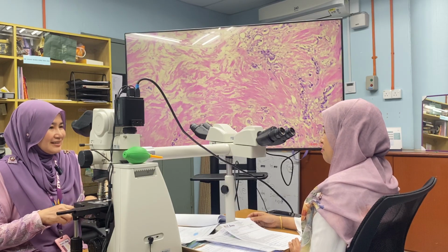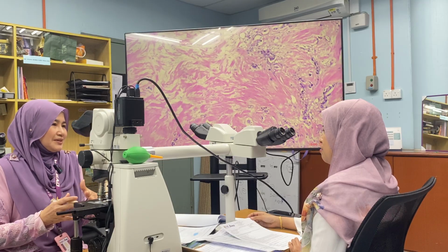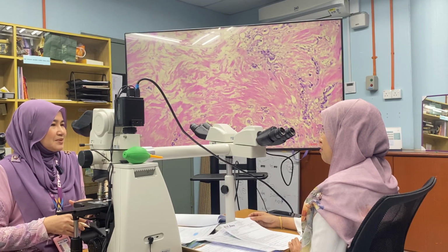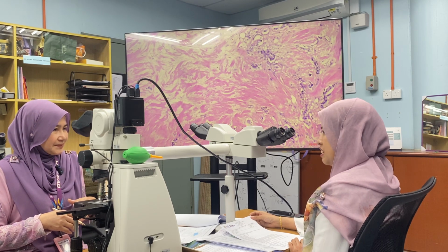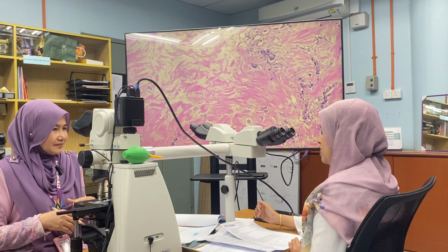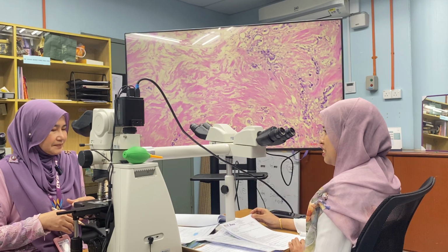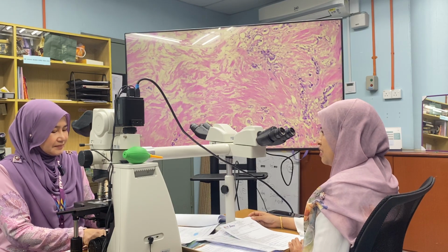Okay. What about the margins? How to report the margin? Is it similar for the mastectomy specimen with the post neoadjuvant? Principally, it's the same. We still measure the distance of the lesion to all the margins and report the closest margin and whether it is involved by the tumor.